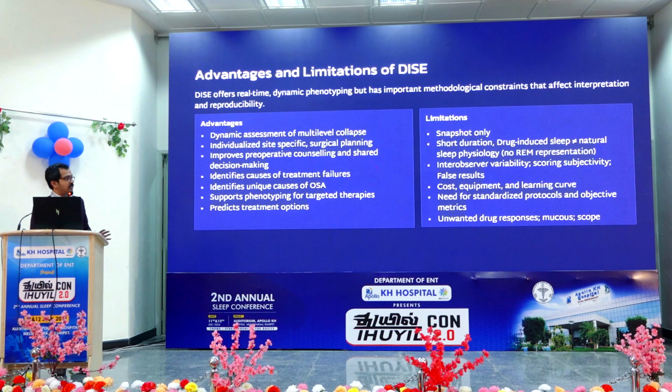But what are the limitations? DISE is just a snapshot. It gives only 15 minutes of sleep, okay, that's all. But normal sleep happens over 8 to 10 hours. Drug-induced sleep endoscopy is not natural sleep, and there is no REM representation. There may be inter-observer variability.